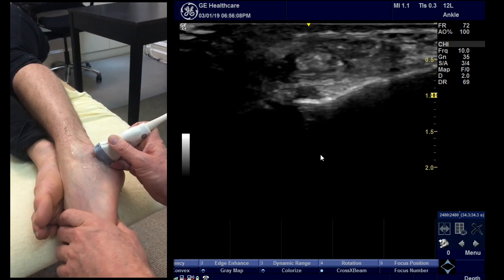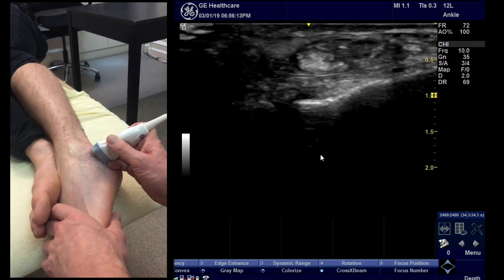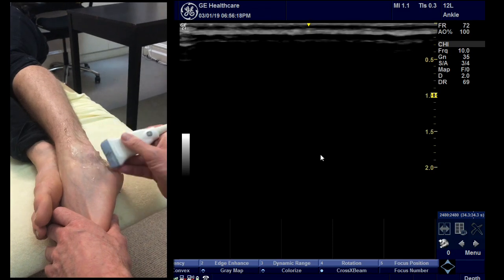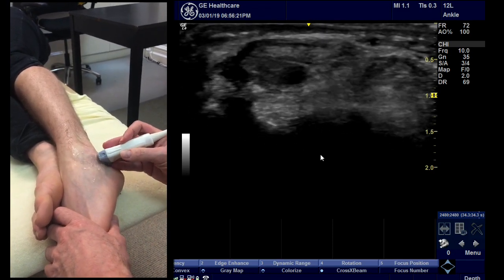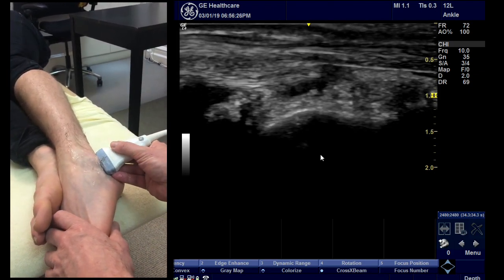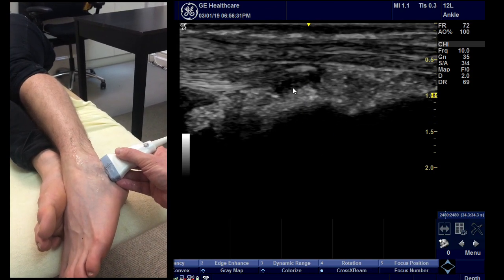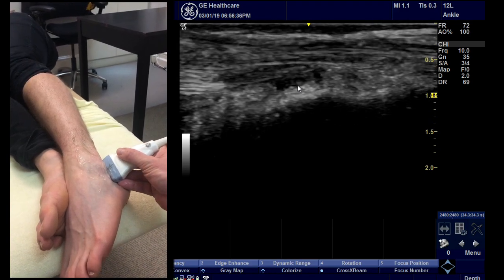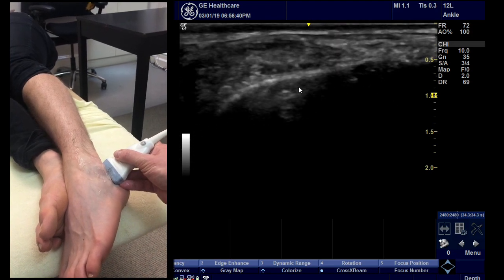Simply plantar flexing the foot does the same thing. Then turn the probe around — make sure you've got plenty of jelly. Go back into long axis of the ligament, turn the probe around, and there you see the short axis. You've got the peroneal tendons here and the short axis of the ligament there. It's anisotropic, so you can make it bright or dark depending on what you need to make it easy to follow. Then follow it distally.